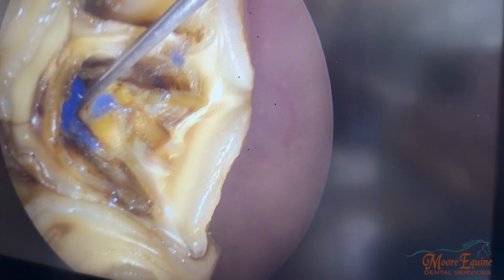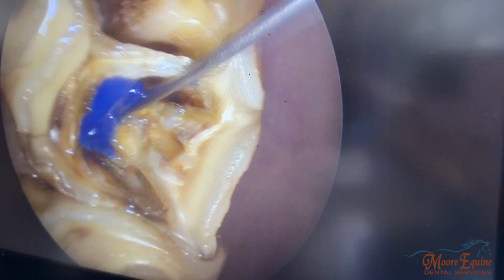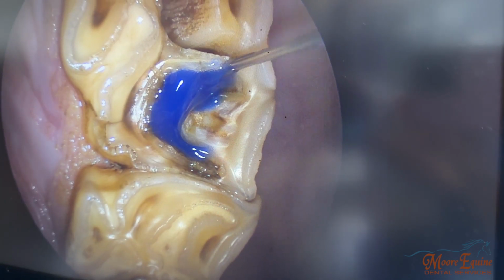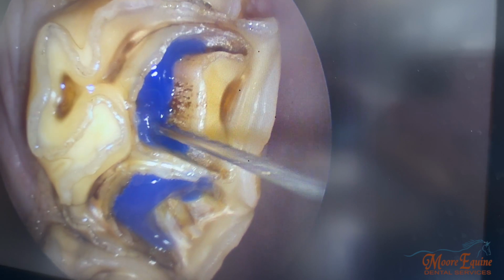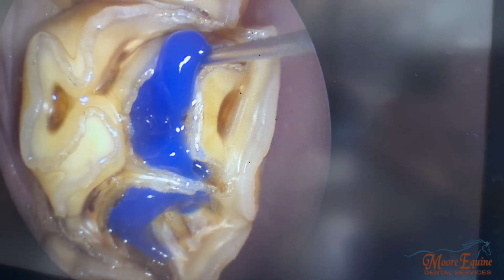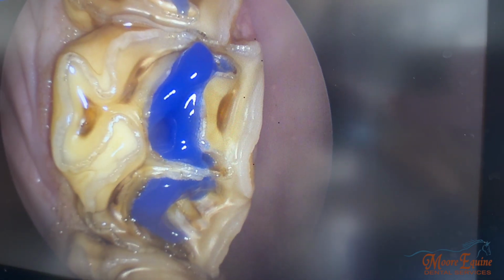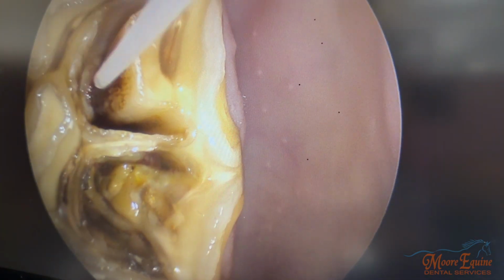Okay, so here we're putting in an acid etch. Get some more bend here. There we go. So this will etch the walls of the infundibulum. We'll let that sit for a little bit, then take it out, then we'll put in the bonding agent, which is like a glue. Then we can apply the final composite layer. So now we're going to apply some of the composite.